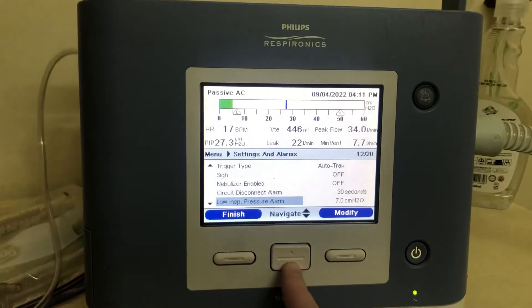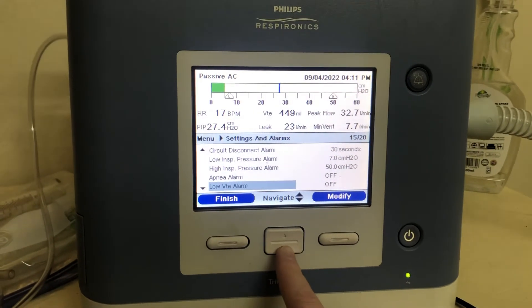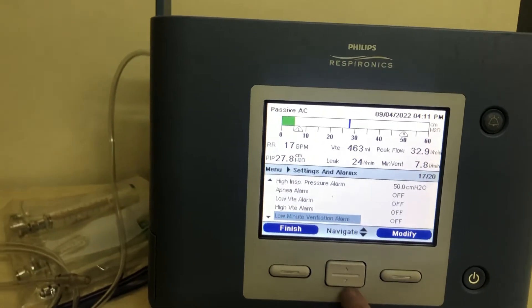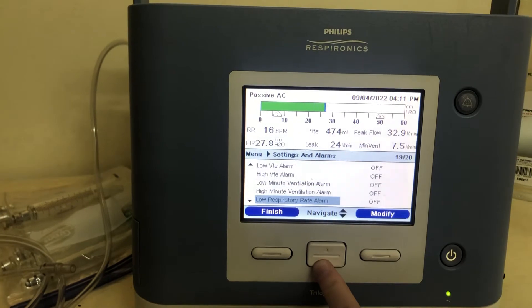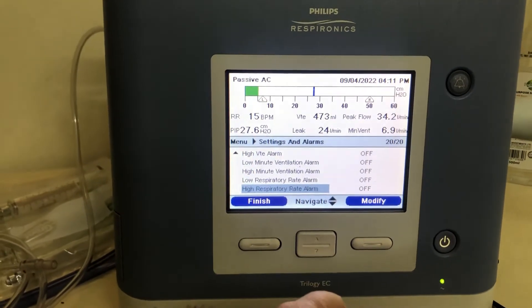Then we go to some alarms. After 30 seconds it will ring a disconnect alarm. Low inspiratory pressure is set at 7, high inspiratory pressure at 50. I've got a few of these alarms off — apnea alarm, high and low tidal volume, low minute volume, high minute volume. Depending on your patient, you can set these as you would for a normal patient.